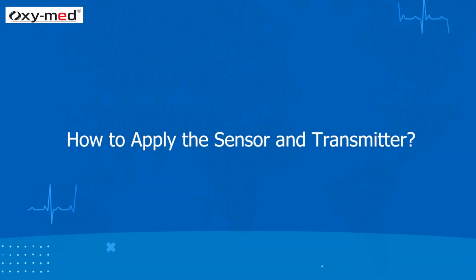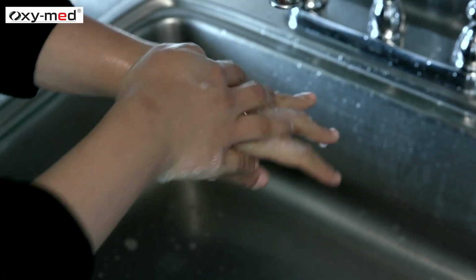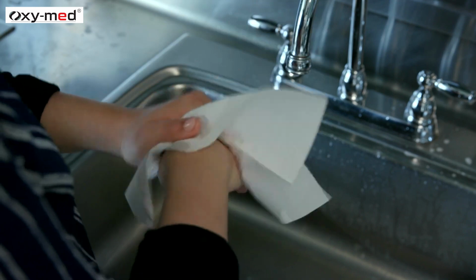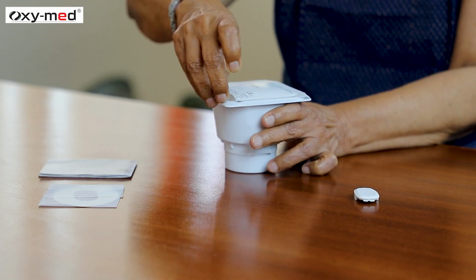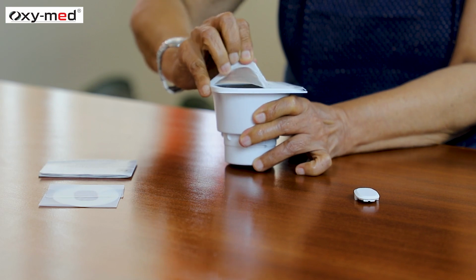Now let us see how to apply the sensor and transmitter, preferably on your abdomen or on the back of the arms. Wash and dry your hands before applying the insertion. Here we have the Oxymed Aidex CGM system, including an applicator with a built-in sensor.